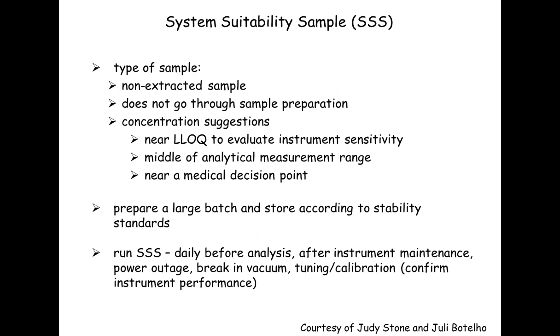So what's your system suitability sample? It's essentially a non-extracted sample. It does not go through sample preparation, and so this is really just a test of your instrument. It's not a test of your sample prep process. It's a test of your instrument on the day that you're running. Some different concentration suggestions are that you should have it near the lower limit of quantitation to evaluate your instrument sensitivity. You could have it in the middle of your analytical measurement range, or near a medical decision point.